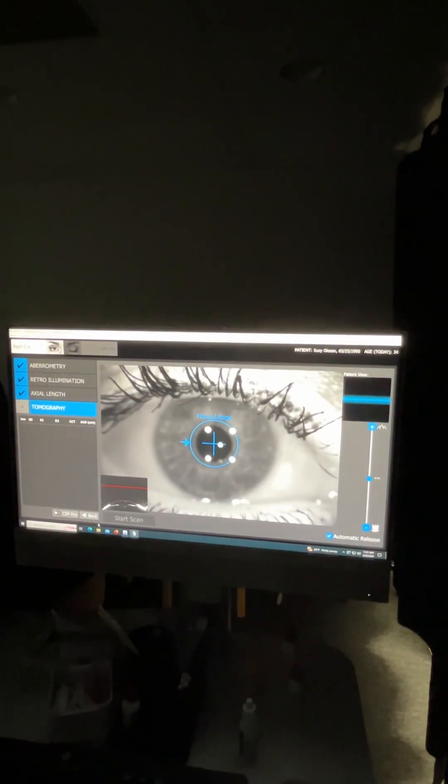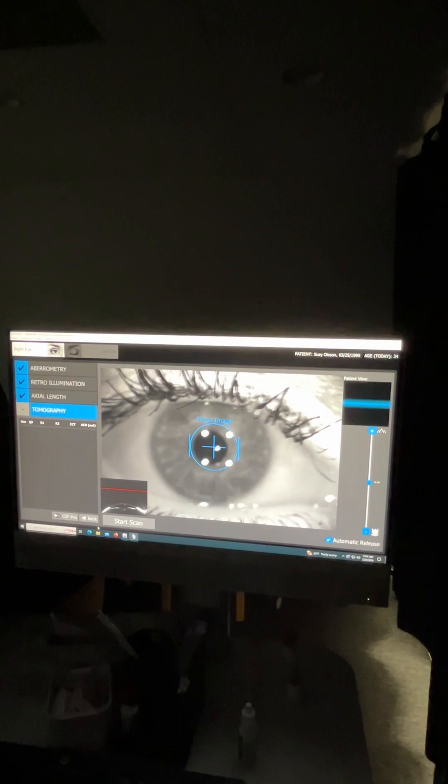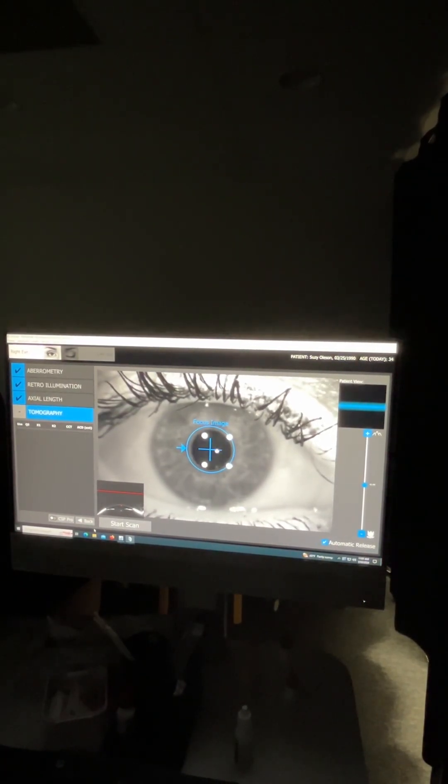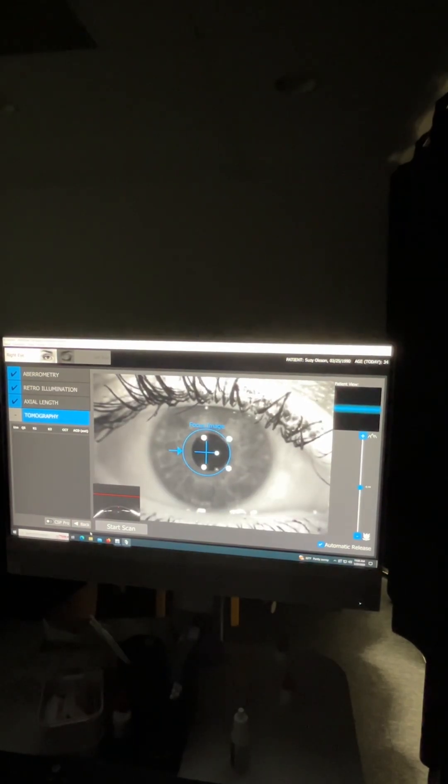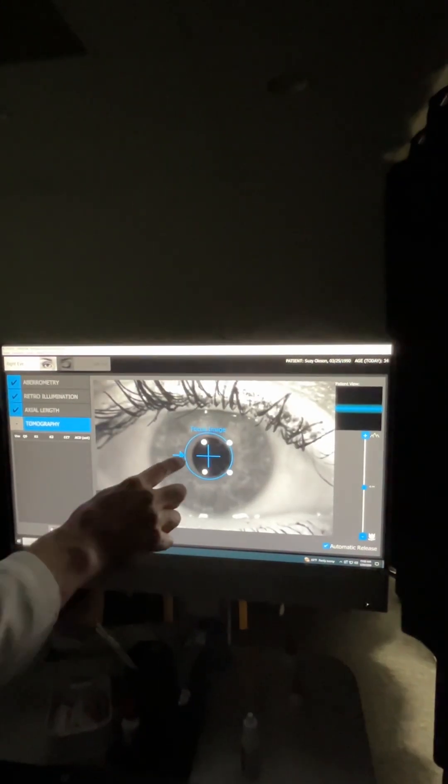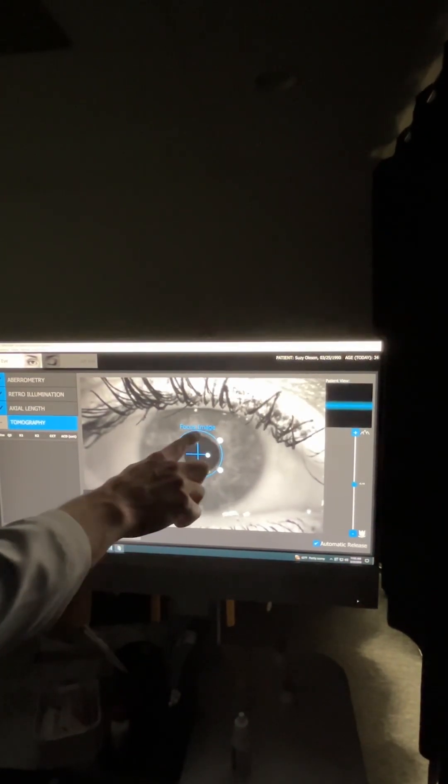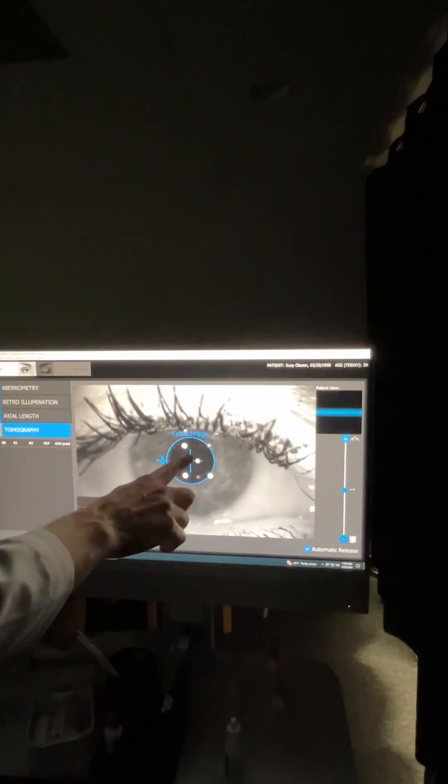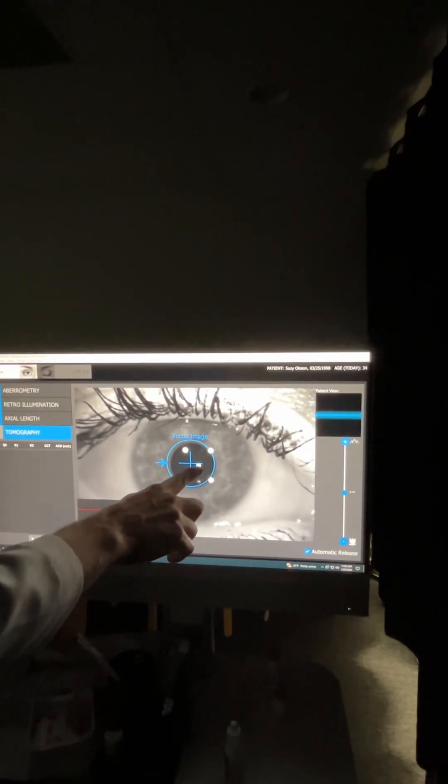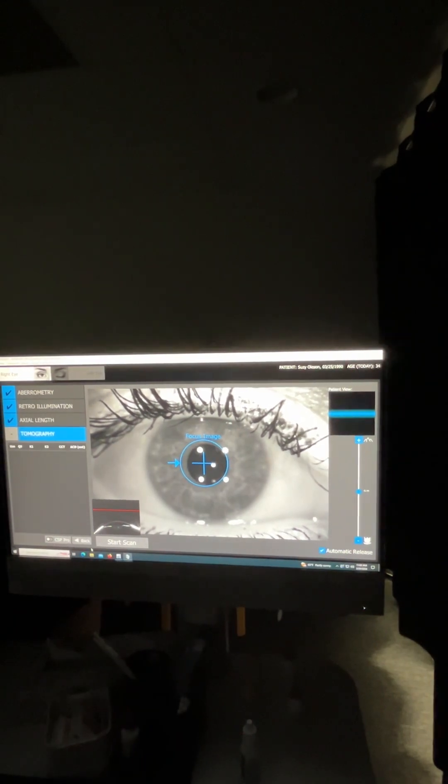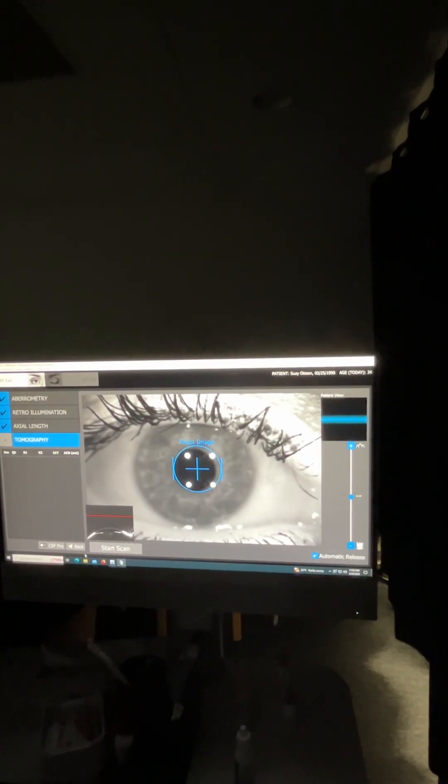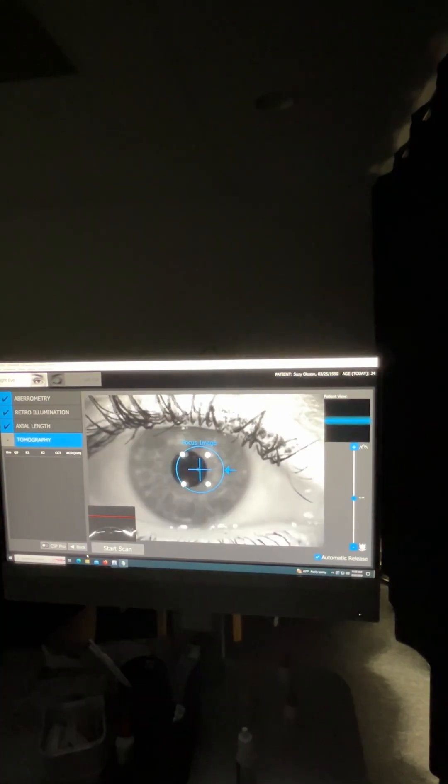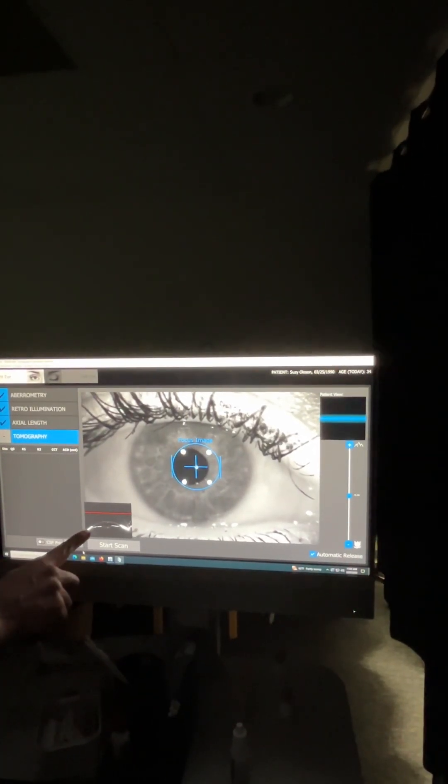So now this is the tomography. Tomography is going to be mapping out the cornea, but again, it also will map out the anterior chamber. Like the other scans, you're going to try to get the white dots to be as in sharp and in focus with the blue around it. And then the blue crosshairs, you're going to get right in front of that central dot. The fixation is essentially the same. You've got that flashing red line.